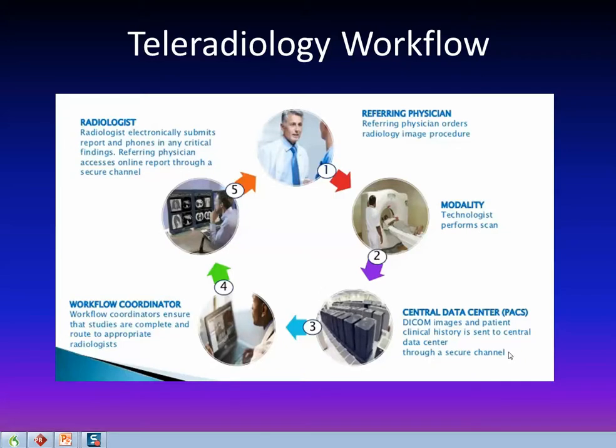We're going to talk about the teleradiology workflow that we go through to exchange information. Just as a global overview, this is the ordering physician. He sees the patient, he's going to order an exam. That's going to go on to the modality. So the CT scan is done.